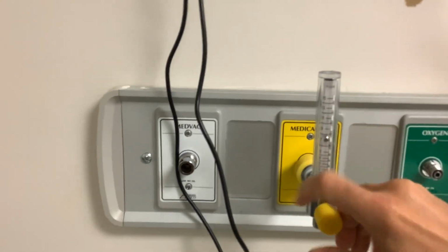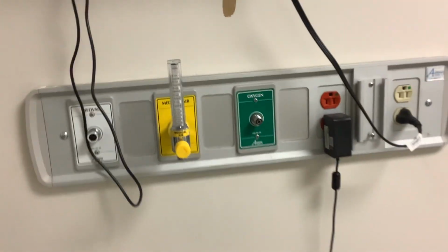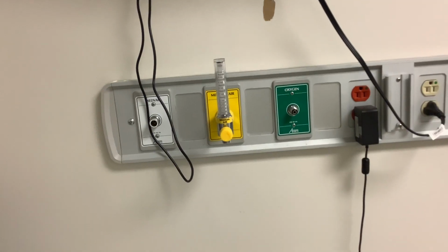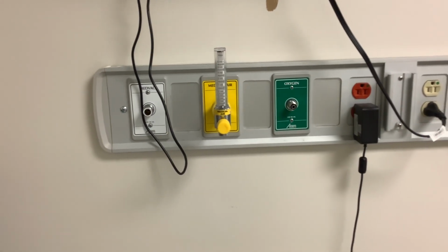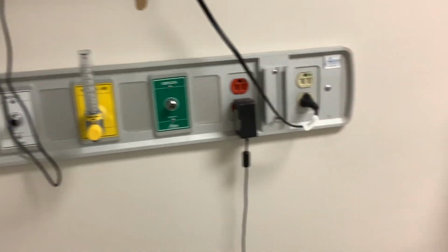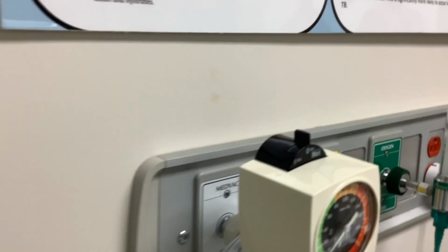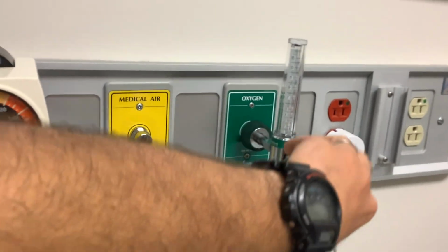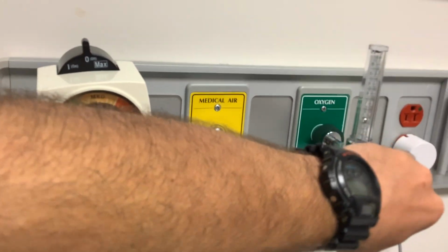So that's important as I utilize a bag valve mask in a code blue situation, or if I'm utilizing a non-rebreather, or if I'm trying to satisfy the total amount of flow going to an individual, I will keep that in mind, that an oxygen or air flow meter can provide more liter flow than just what's calibrated. Same thing with our oxygen flow meter. You would still read that the same and utilize that.